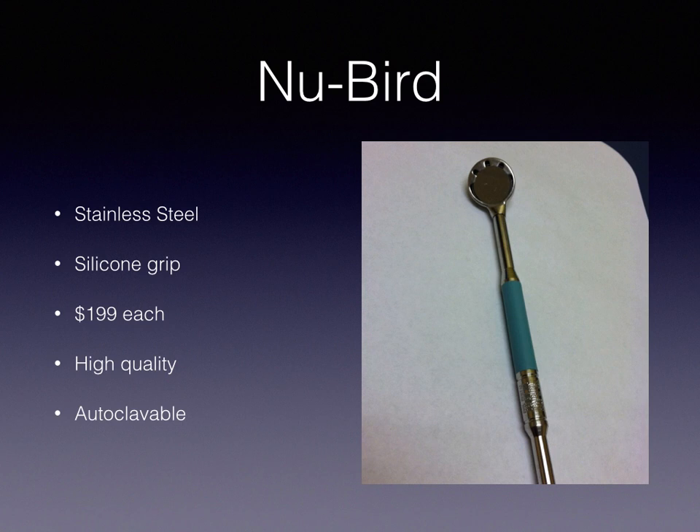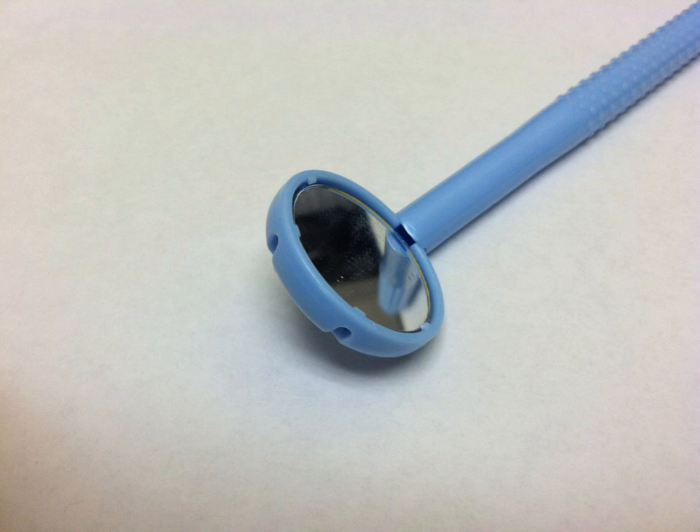Here's a close look at the Mirror Vac back. You can see the suction holes — basically half on the side and some on the back. These come with a little protective film on top, so when you use it you just peel that off. Since it's a one-time use, you throw it away after.